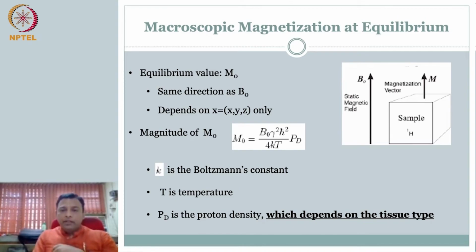So that is your M0. Essentially what we are getting towards is, you take a sample volume, and if you can measure M0, you choose a magnet so B0 is chosen, and the gamma frequency you are tailoring to hydrogen. So the signal strength that you are getting corresponds to the hydrogen frequency. Then M0 is directly proportional to only the number of protons. So if I choose my sample from different locations, if a sample has more PD, then it will have more signal.